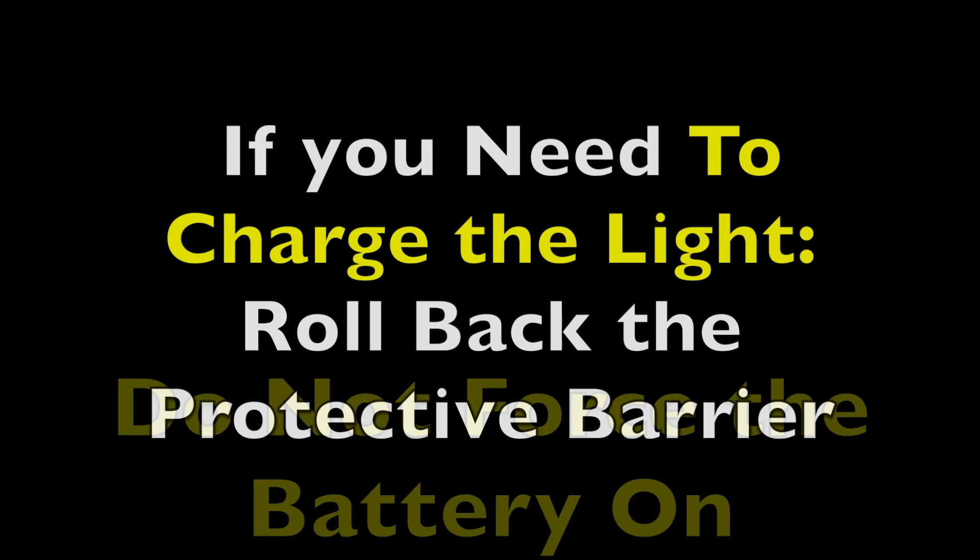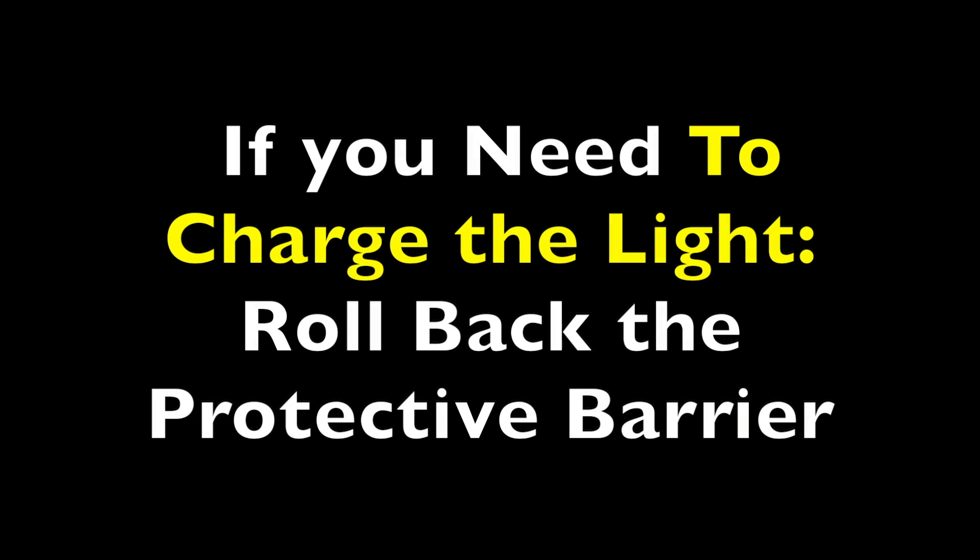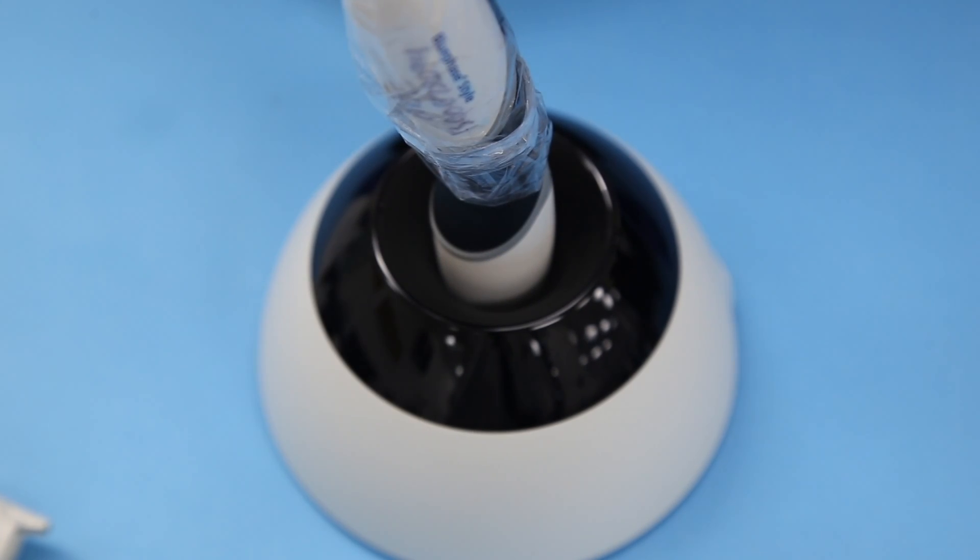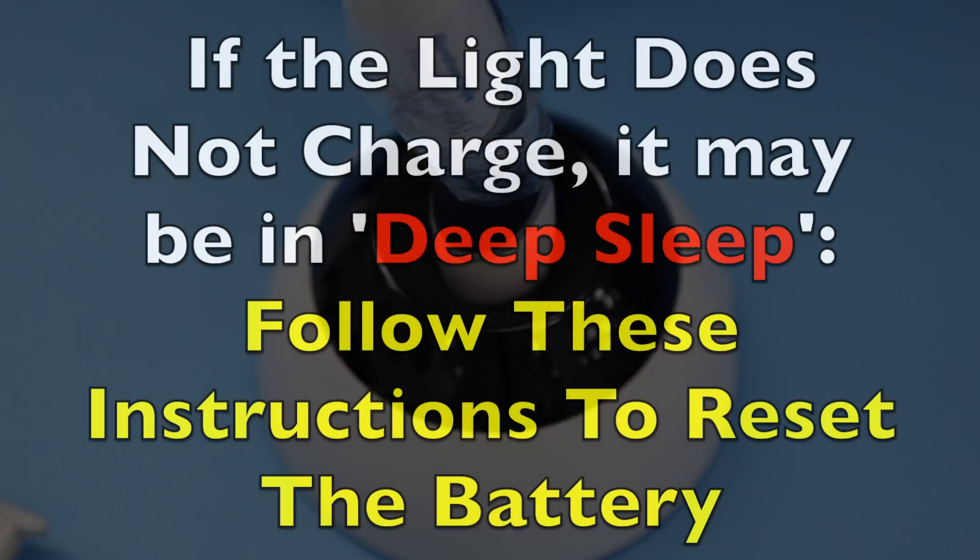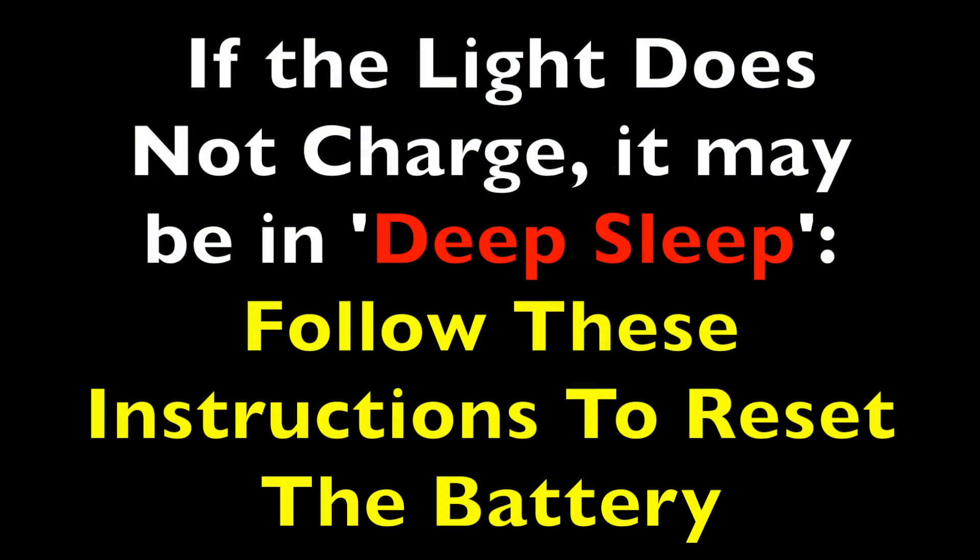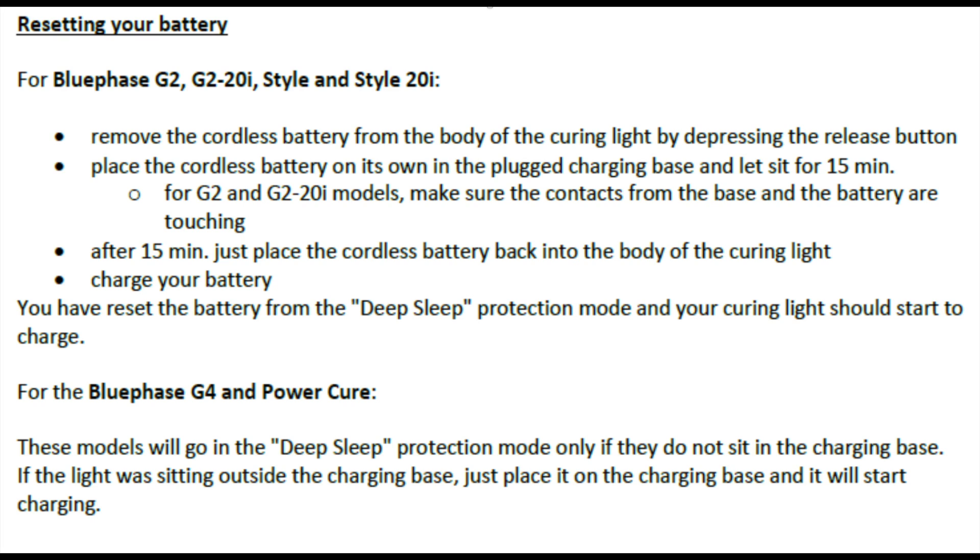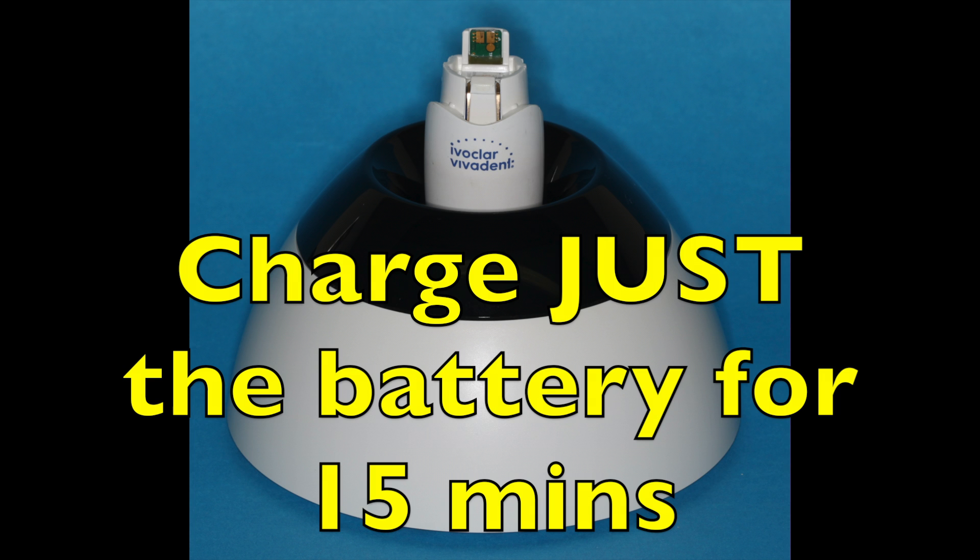I find it charges a lot better if you roll back the barrier. If you haven't used the light for some time, it may have gone into the deep sleep mode. This is easily fixed by following the information that's available on the website. You just need to remove the battery from the curing light and then charge the battery alone for about 15 minutes. After which time you can reconnect the battery on the light and it should work just fine.